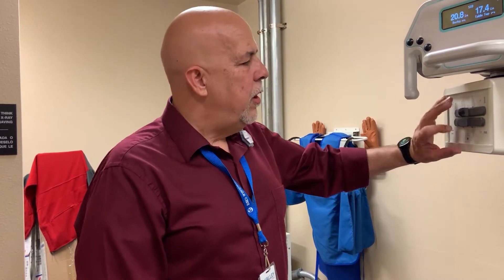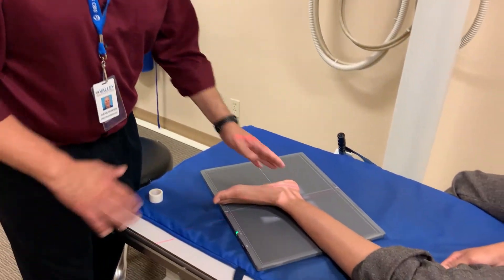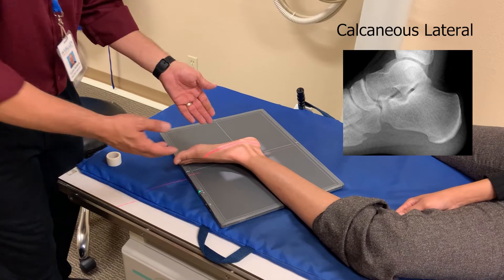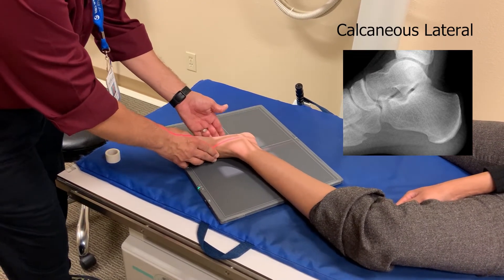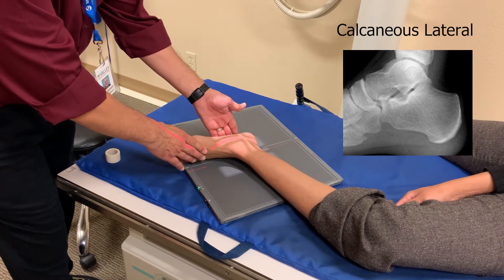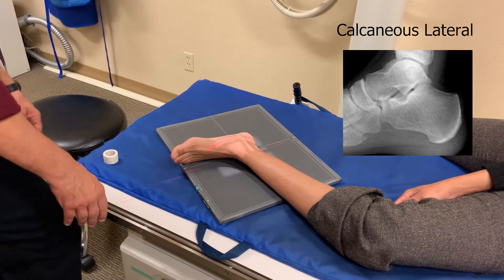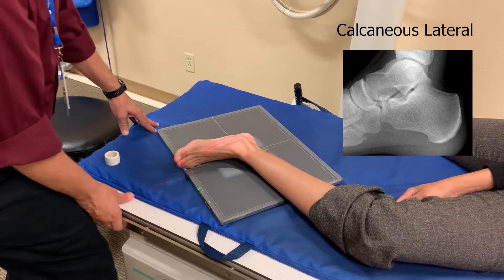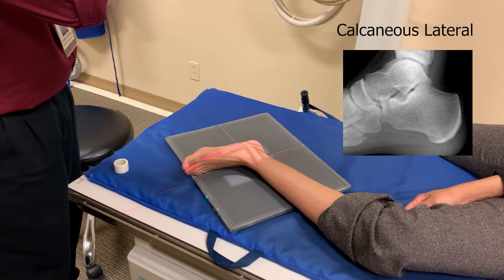Hello again, this is Glenn. This time we're going to do a calcaneus — also your heel. We're going to do the lateral first. When you do the lateral, you want to make sure that the knee and the ankle are in the same plane. And just like when you're doing a lateral foot, you want to make sure that the plane of the plantar surface of the foot is perpendicular to your IR. So you want to sit on the calcaneus and collimate just the calcaneus.